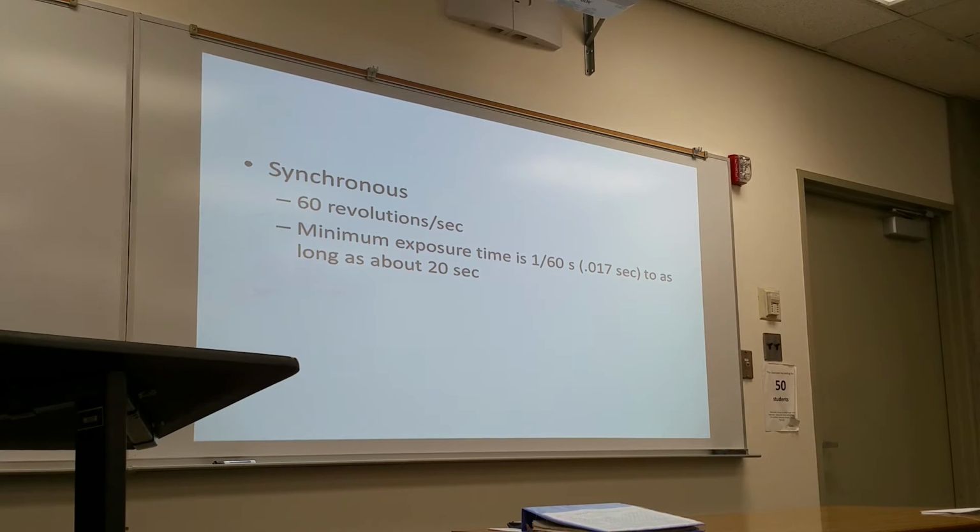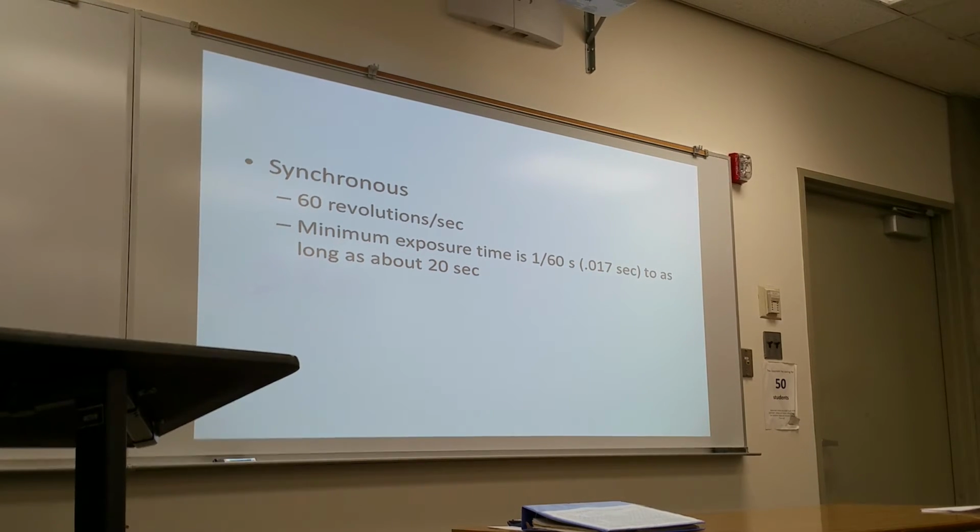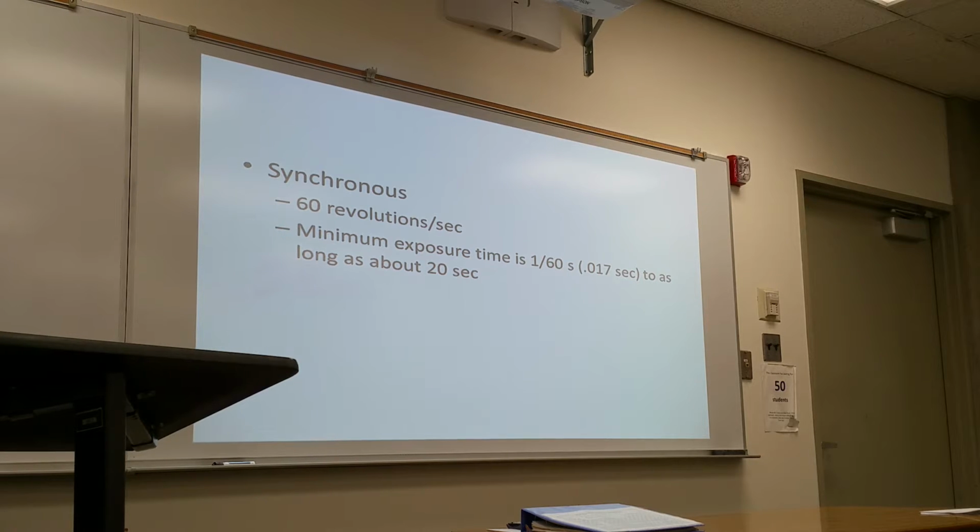We have the synchronous timer. This is more accurate than the mechanical timer. I call it synchronous because it's based on the hertz going through the system. The electric cycle is 60 hertz, so it's timing based on 60 revolutions per second. I don't know exactly how it works, but it works on synchronization of the electricity coming in, which is 60 revolutions per second.